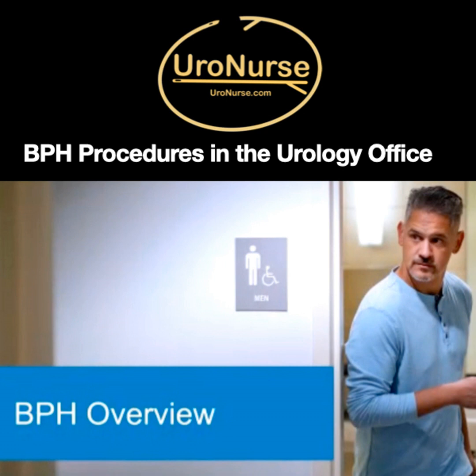Sexual function is preserved, which is true for both of the minimally invasive treatments. It works great for patients with the middle lobe, and yes, Urolift is approved for it. I have treated some patients with Urolift with middle lobes. It's got to be the right kind of middle lobe. It's got to be mobile. It has to be big enough that you can sort of swing it off to the side.